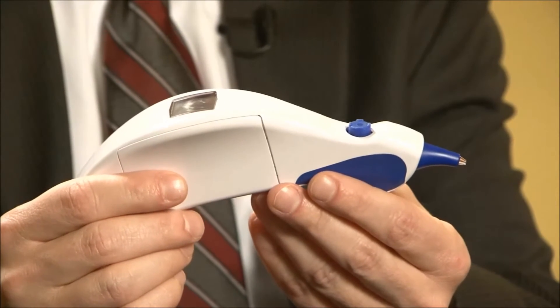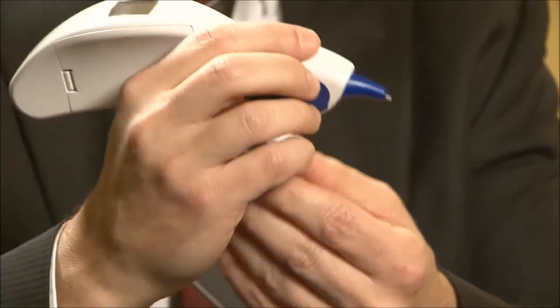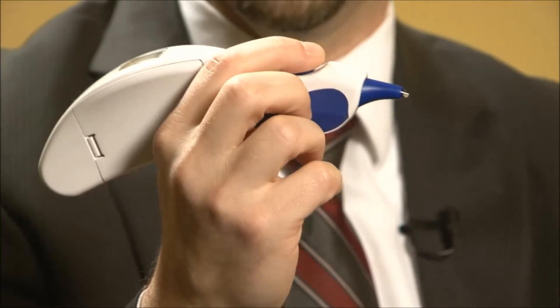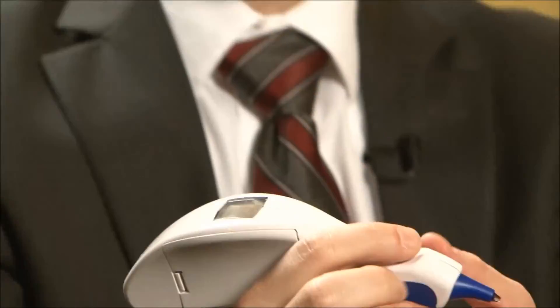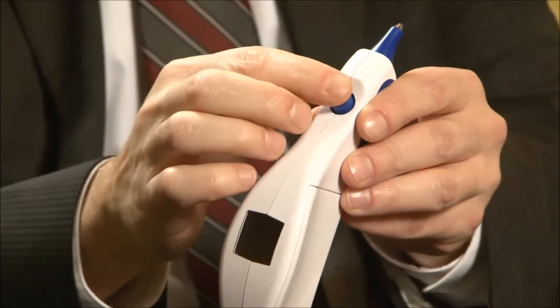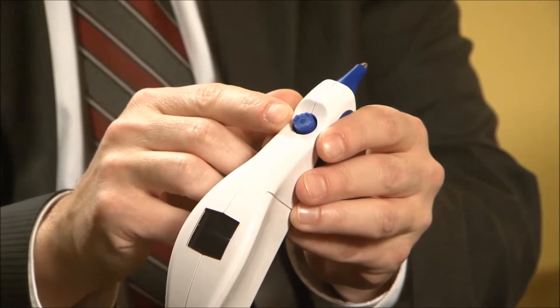The design of that product came out of an 18-month long ergonomic study that was responsible for the ergonomic design of the instrument, so it fits very comfortably in your hand. It features a five-way control button, so all of the features of the instrument can be accessed by this single button right here.